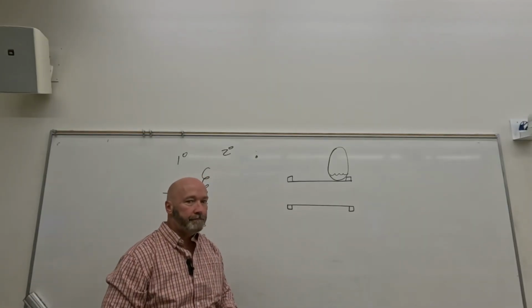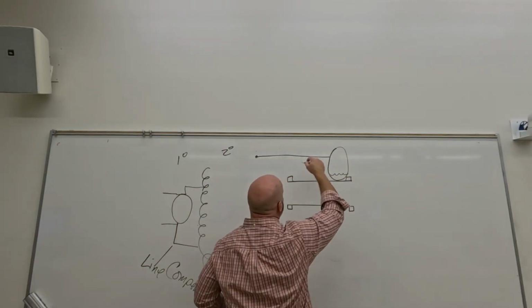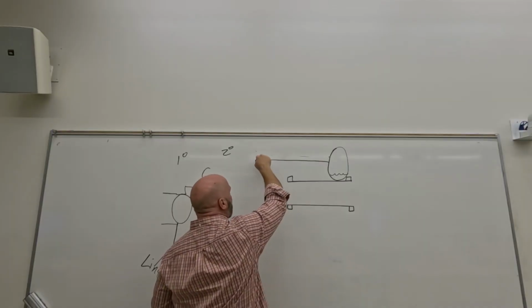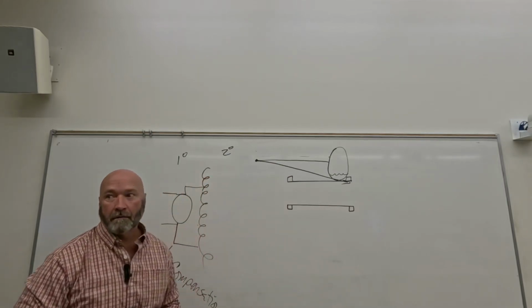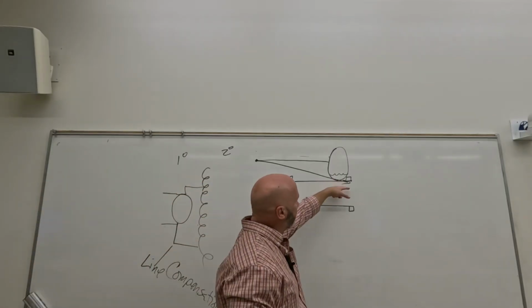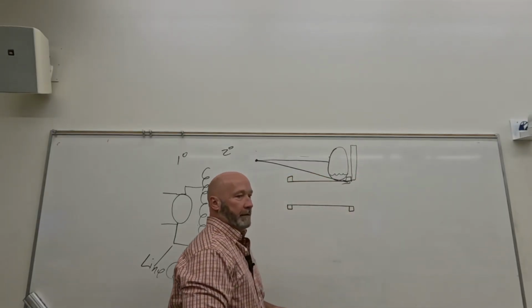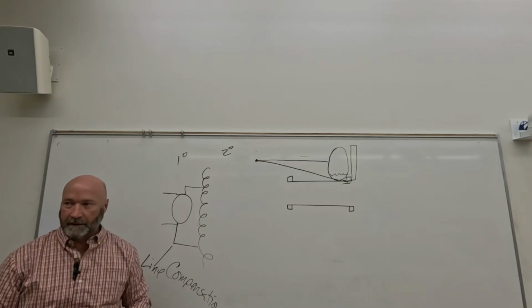What do we call that? Beam divergence? Divergence, exactly. So you center directly in the center of the patient-ish. And what's happening with the lower portion of this x-ray beam? The divergence, right? So what's going to happen with your pleural effusion if your image receptor is sitting right here? It's going to have to go through that big hunk of metal, so it's going to cast a mighty artifact, right?